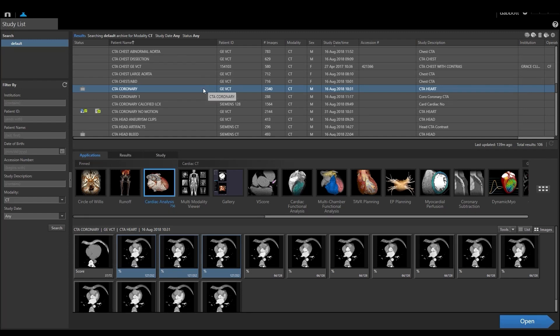First, I'm going to select my patient. I'll come down to the Applications tab, select Cardiac Analysis, and select my three phases that are thin-sliced images I'm going to use for the evaluation. Then I'm going to select Open.